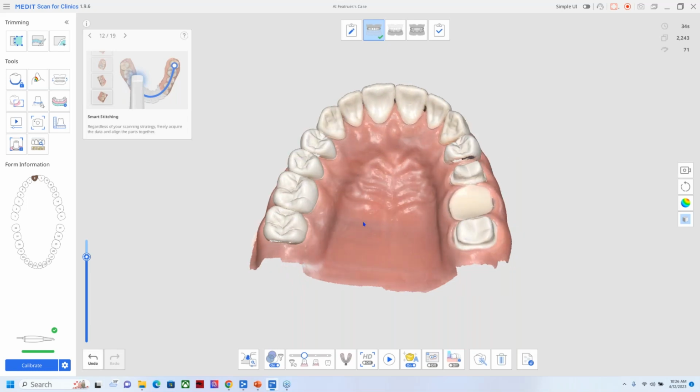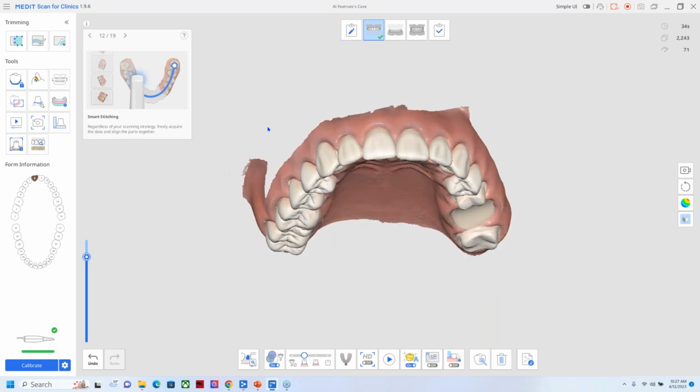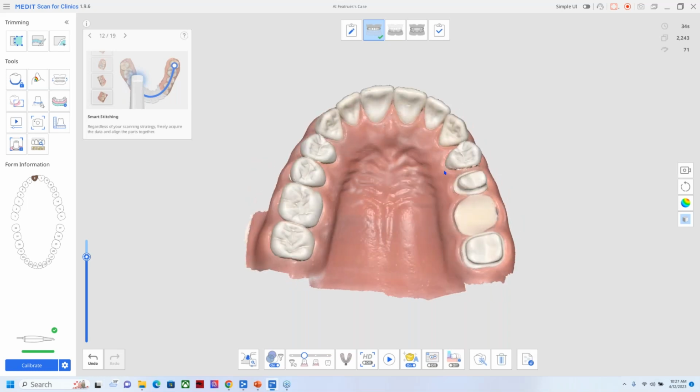I'm going to put my scanner down and jump right into basically the first AI feature we'd like to talk about, and it's smart scan filtering right here at the bottom of the screen. We're going to start with the second option here. This is set as default, and this is teeth and gingiva. So this basically scans teeth, all gingiva, hard palate, but it does filter out soft tissues. So cheek, tongue, lips, it will filter those out, making scanning significantly easier now.